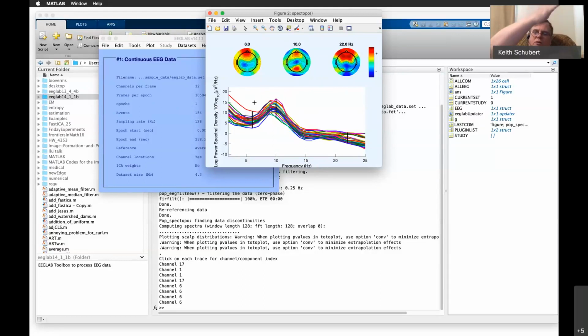If you see it where it comes down and goes back up again and then levels off, that's very characteristic of an EMG. So if it was higher through this frequency range, a dip down and then up at the low end, doing that type of shape, I would tend to think that's more of a muscle response. You'll get that heavily, particularly at the back of the neck. Those channels will have EMG noise.